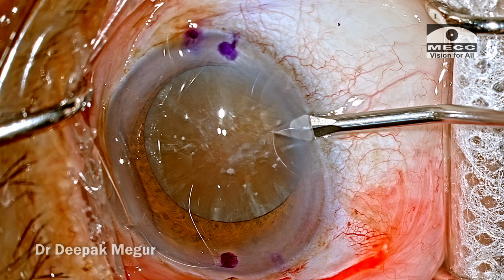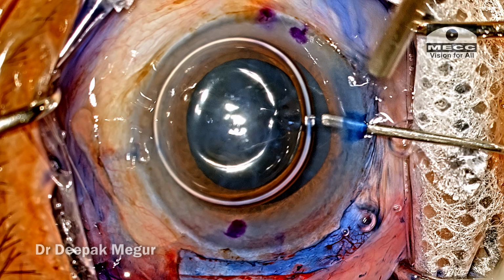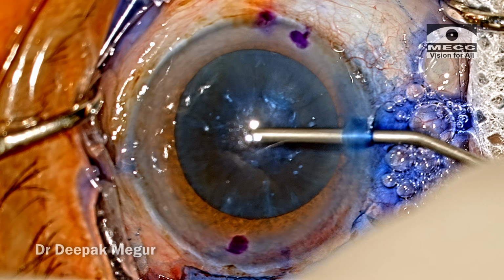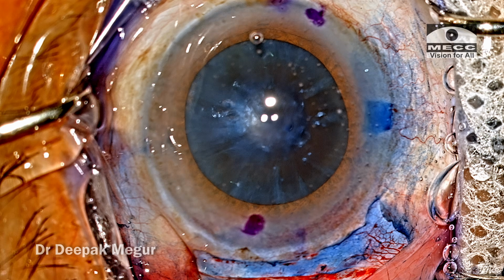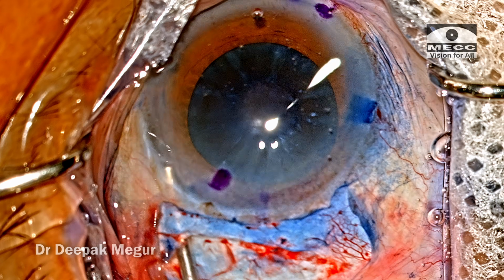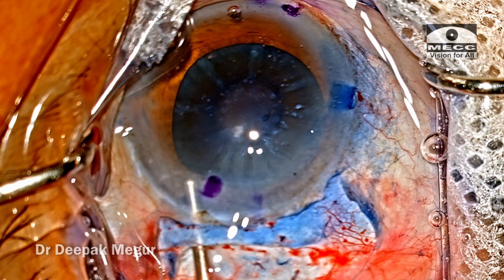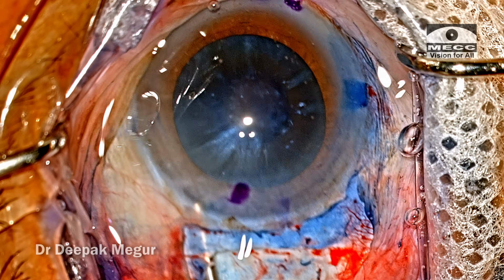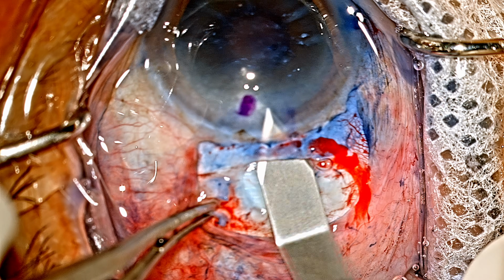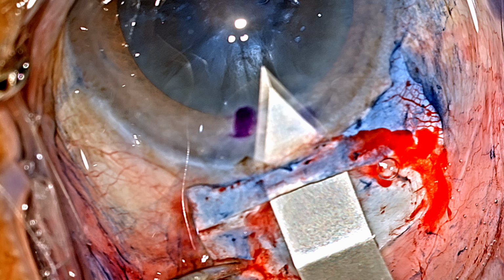The side ports are made, the capsule is stained under the air bubble, viscoelastic is placed inside the anterior chamber. And now is the time to perform the entry into the anterior chamber through the scleral tunnel. I prefer to put in viscoelastic in the tunnel so that it just lifts up and guides my blade nicely, and I can go and visualize the far end of the internal lip, before which I am going to perforate the Descemet's and enter into the anterior chamber using the 2.8 mm keratome.